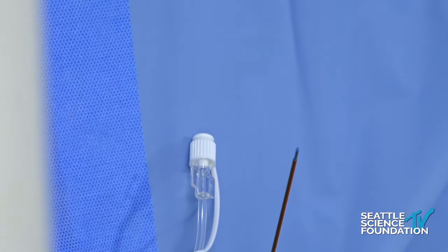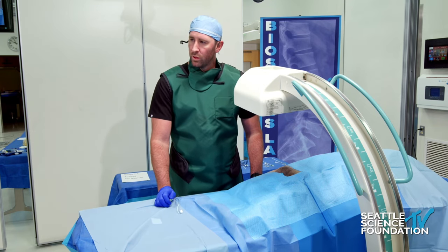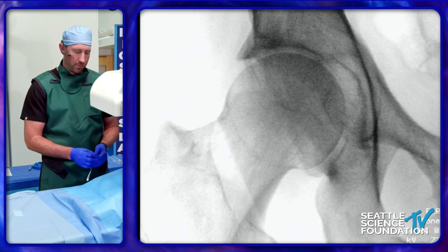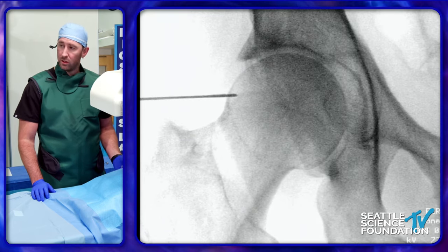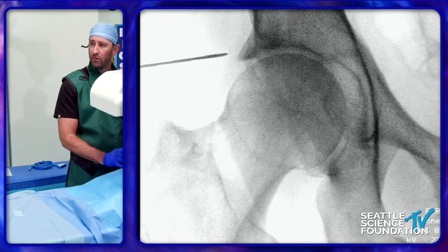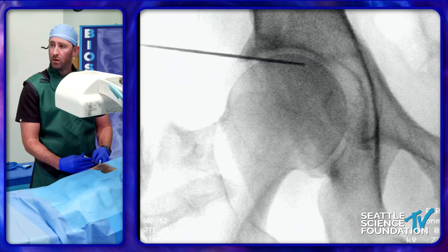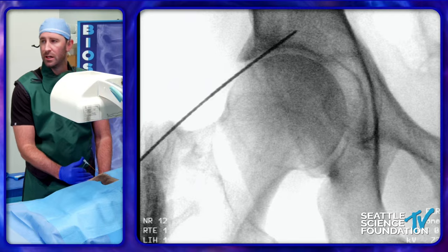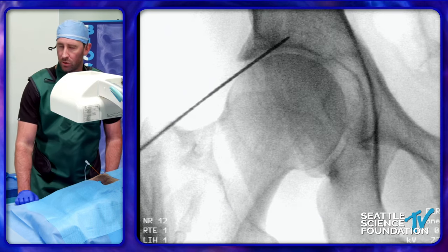For the hip setup, we're going to get the obturator foramens lined up and symmetrical. We're going to target both the articular branches of the femoral and the obturator nerves. For the femoral target, we start out lateral, go right up to the superior acetabulum, and walk our way down to dock right at the 12 o'clock position. That 12 o'clock position is the target for the femoral articular branch. Once we have the needle in position, we're going to stimulate for motor and sensory.